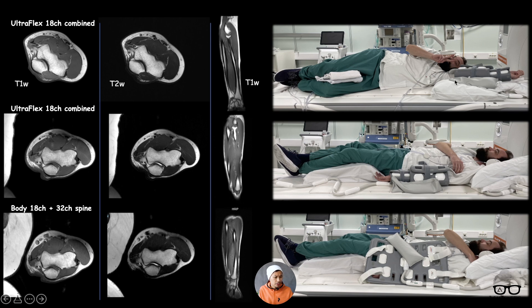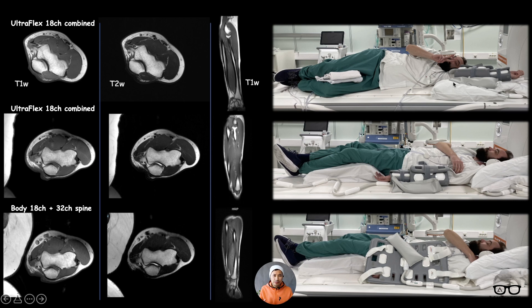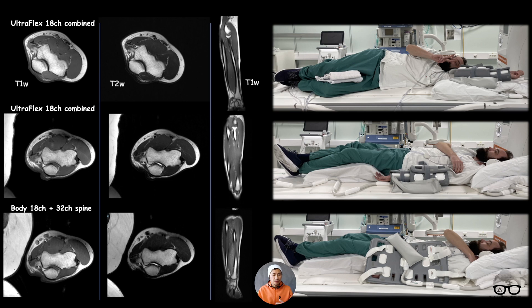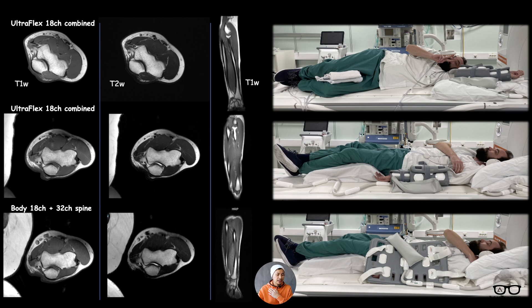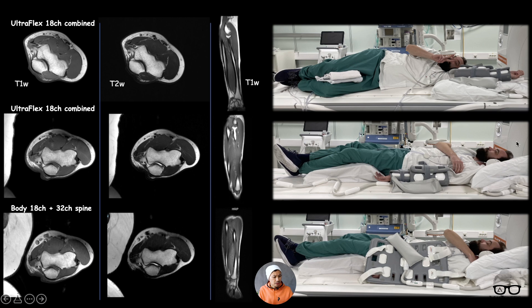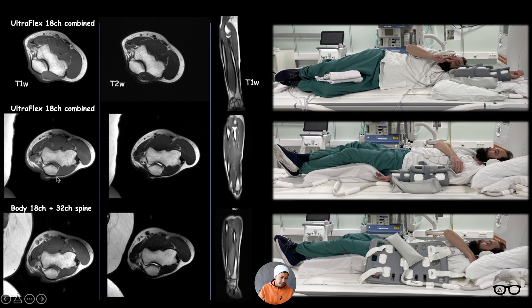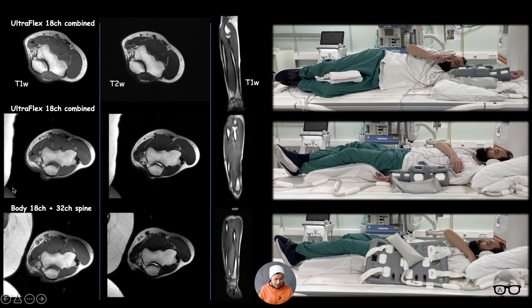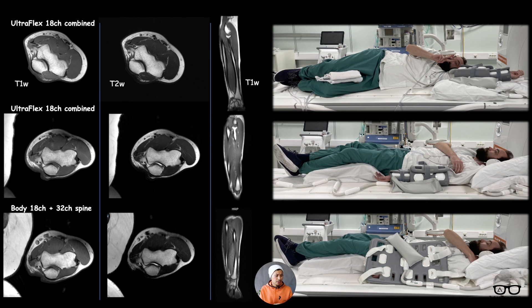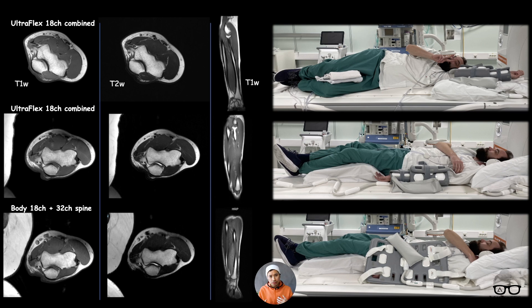For the first position, you can see the T1, T2, and coronal with the arm lying forward. It's okay for a certain amount of time, but if the scan or examination is too long it becomes very difficult — the shoulder will hurt. The most comfortable way is arm downwards.